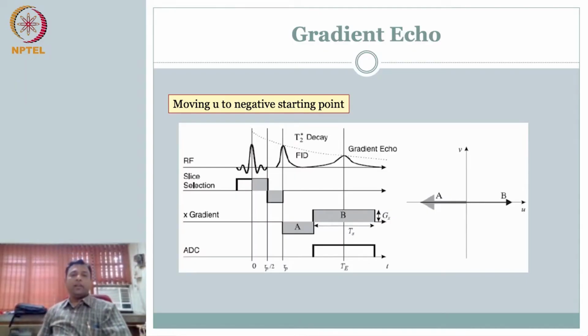Okay, so welcome back to the next session. We left it at a very nice point, right? The previous video we left it at the end of gradient echo. What we were trying to do is we have a slice selection, we know how to encode the readout direction or the x gradient to obtain how the signal, where the signal is coming from along the x direction.